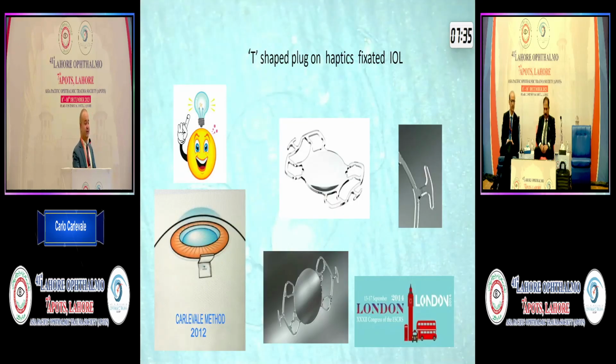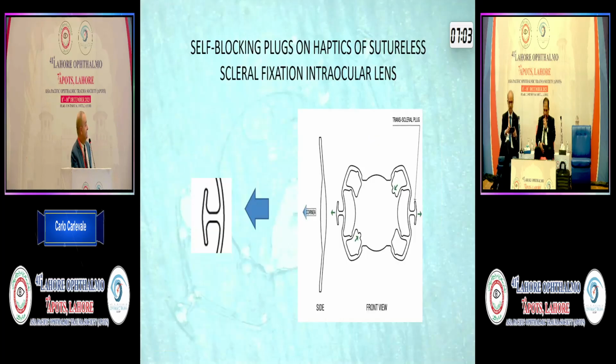In 2012, I had the idea to put a small harpoon on the top of a closed-optic intraocular lens in order to fixate a lens to the ciliary sulcus in case of lack or absence of capsular support. Since the beginning the procedure worked perfectly, so I presented the first 9 cases at the European Congress of Cataract and Refractive Surgery.